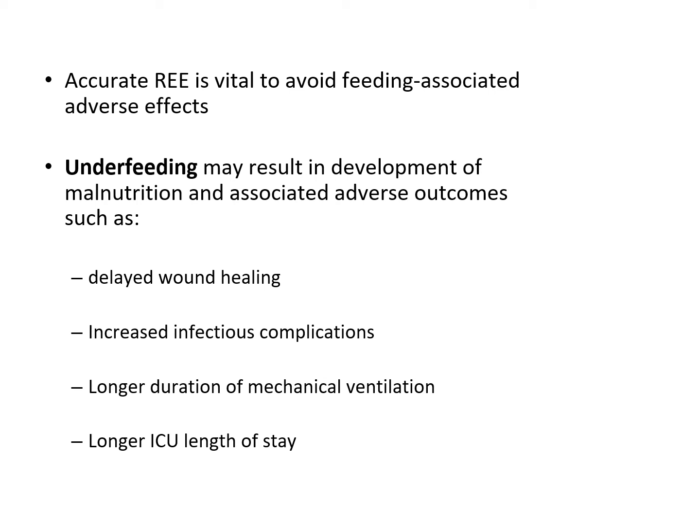Accurate resting energy expenditure is vital to avoid feeding-associated adverse effects. So we want to make sure that we're not overfeeding or underfeeding. Okay, so that's why we're getting these measurements, to make sure we're getting the proper nutrition.